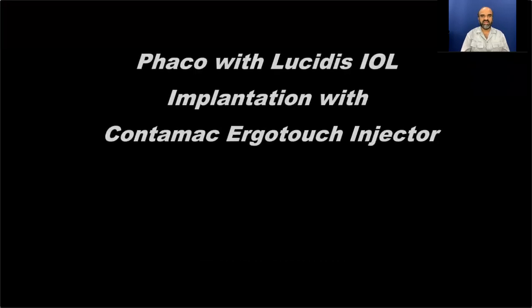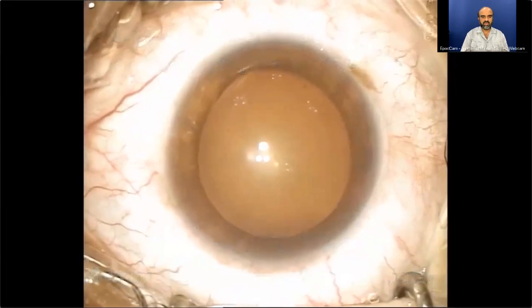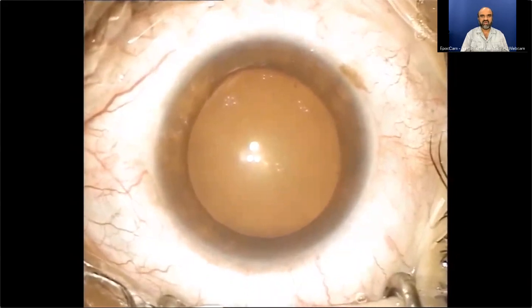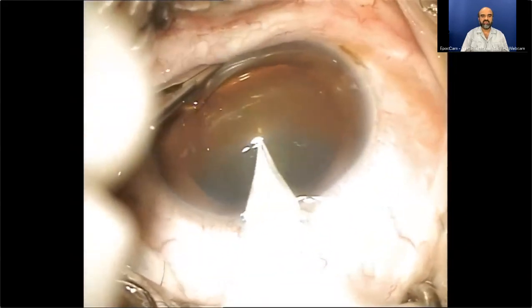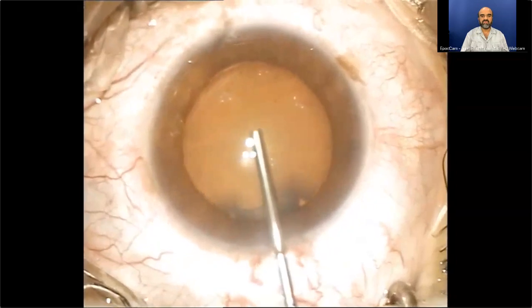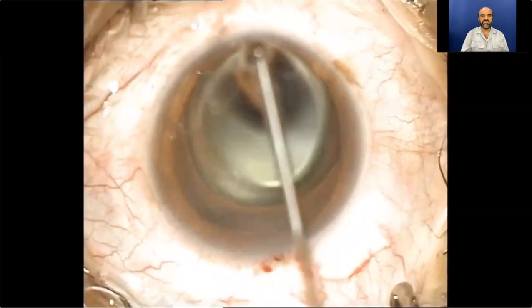Today I am going to discuss phaco with Lucidis intraocular lens implantation using Contamac ErgoTouch injector. It is a relatively soft cataract. We proceed with the incision at 12 o'clock position because this is a steeper meridian in this case, and the patient carries about one diopter of astigmatism, the steeper axis being 90 degrees.